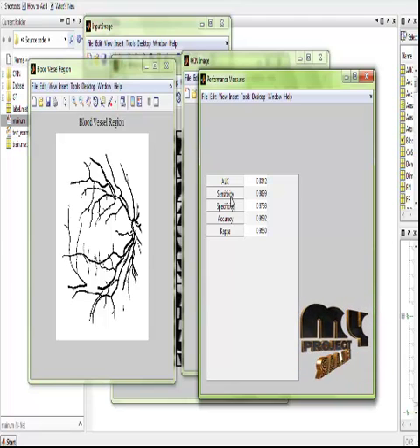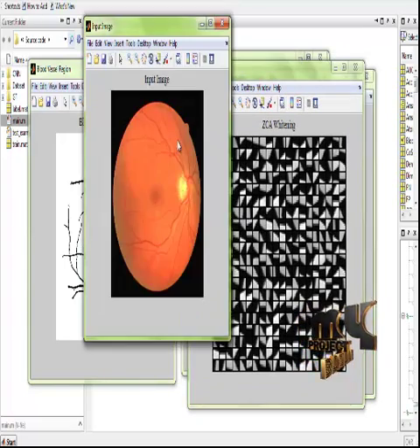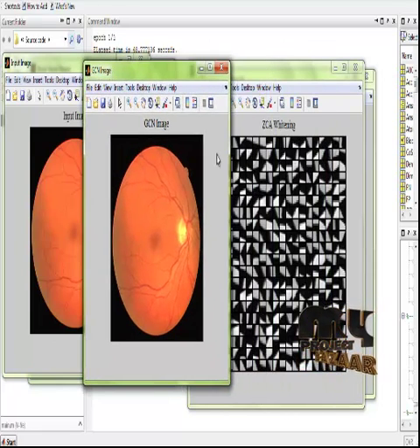Thus, we have segmented the blood vessel regions using the convolutional neural network process. The segmentation process is based on classification using neural networks, and it is preceded by pre-processing steps based on zero phase component analysis and normalized contrast in the global contrast normalization process.